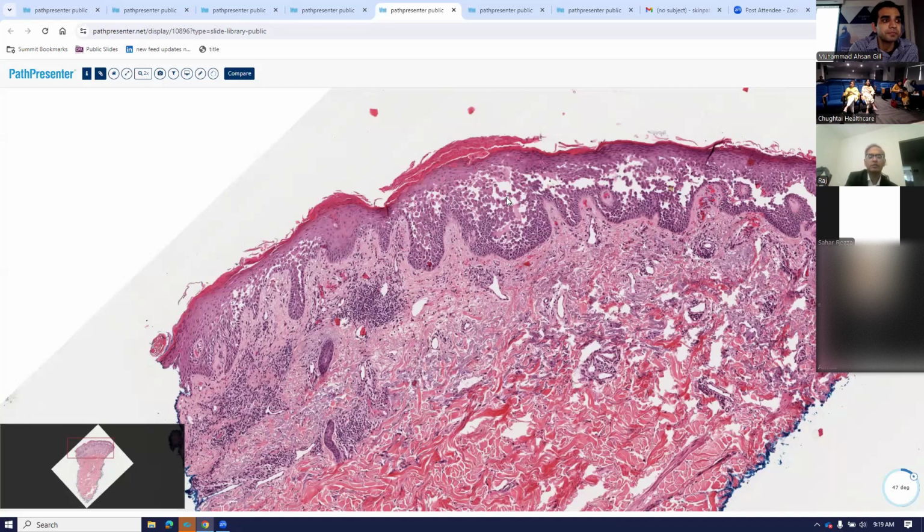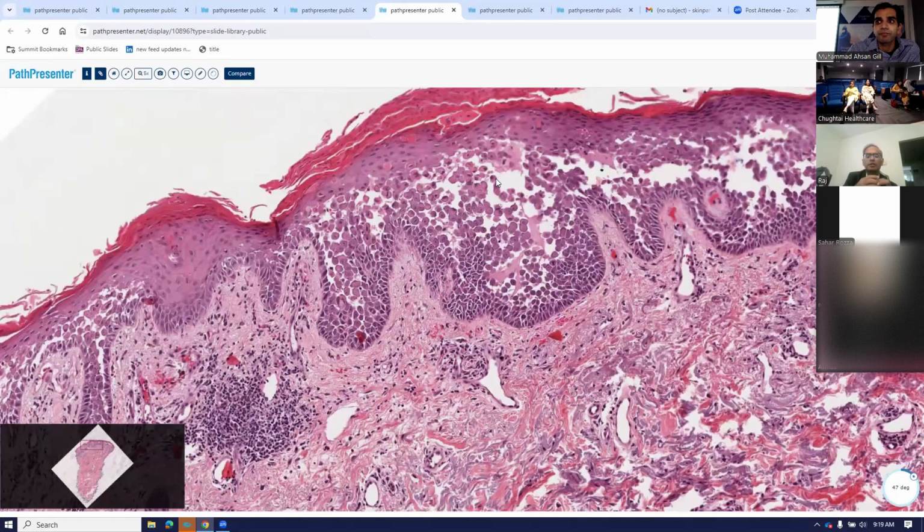So again, regarding the other question, immunofluorescence is important because many times you have to differentiate these conditions. If you see a split in the epidermis that is throughout the epidermis, in the middle layer of the epidermis, sometimes suprabasilar, and you see these floating keratinocytes, what has happened is these keratinocytes have completely broken apart. The term that you're going to read about is acantholysis. There are two terms that we talked about: acanthosis, which is thickening of the epidermis, and acantholysis, which is when these keratinocytes completely break off and you start seeing them floating within the bulla. So that is acantholysis, an intraspinous bulla associated with acantholysis.